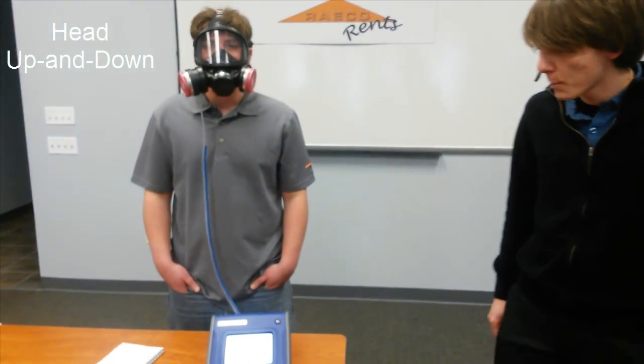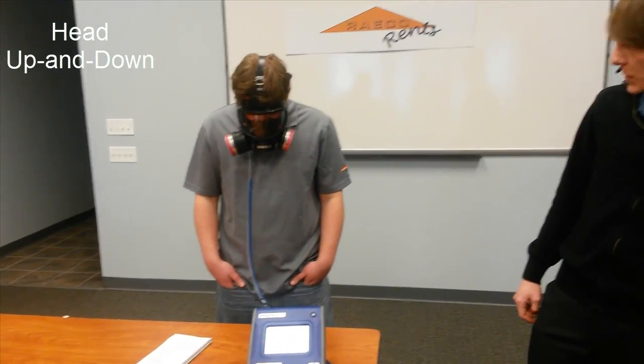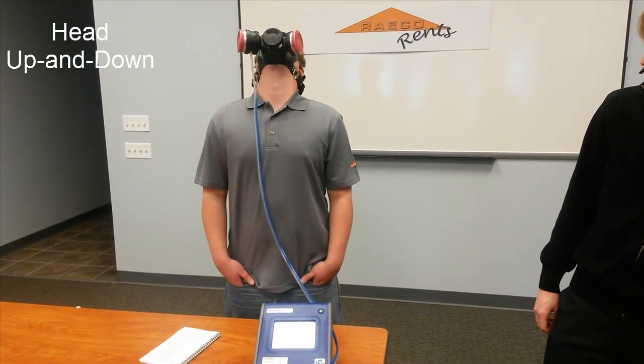Now at the head up and down portion of the test, he's going to maintain his normal breathing practices, but tilting his head as far back and as far forward as he can.